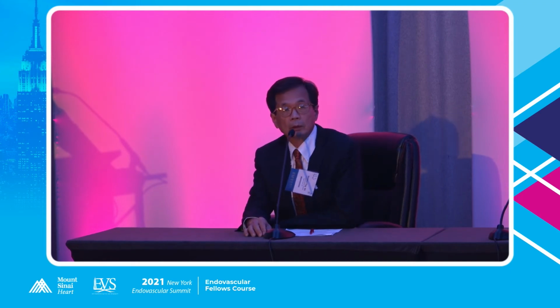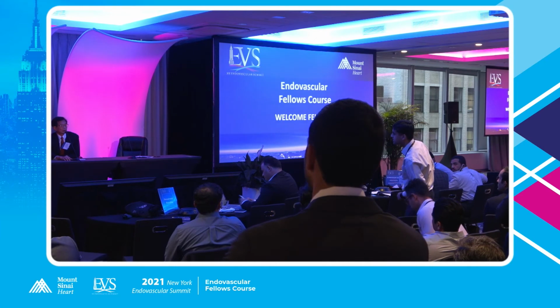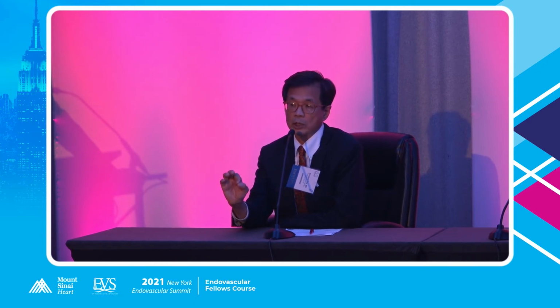Do you routinely oversize the stent in the venous system? And if yes, how much do you oversize? That is a great question, and there are many different thoughts on what size stent you put in these patients. Now, the sizing is a little different for Wallstent versus the nitinol stent. Let me just talk a little bit about Wallstent.